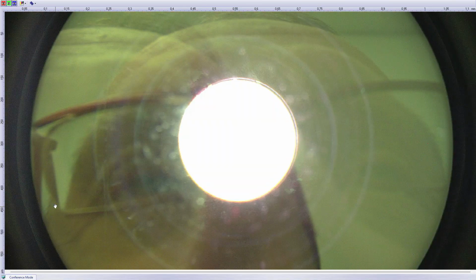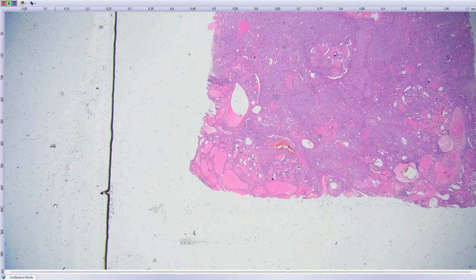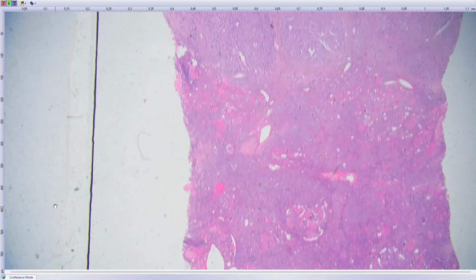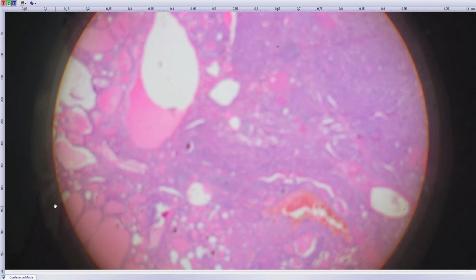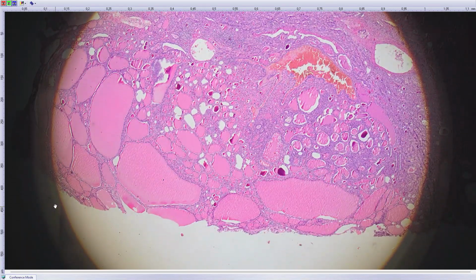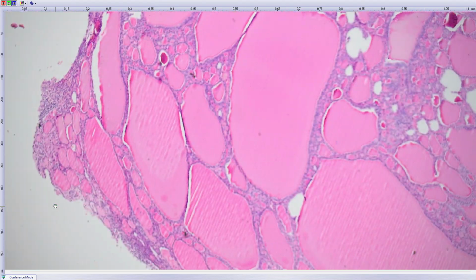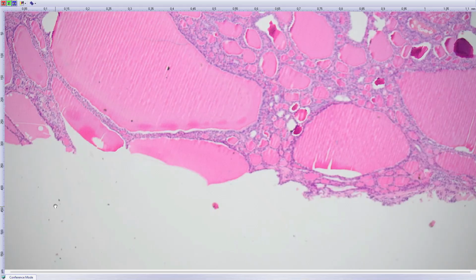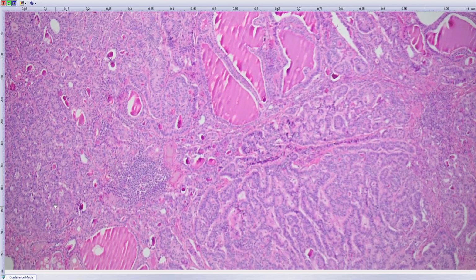Here I have an ovarian tumor. It was quite large. I do not remember precisely how large it was. You can easily see here, this is part of the lesion which is easy to diagnose. It is colloid struma of the ovary. But beside that, there is this.